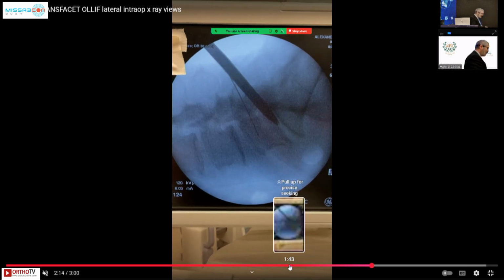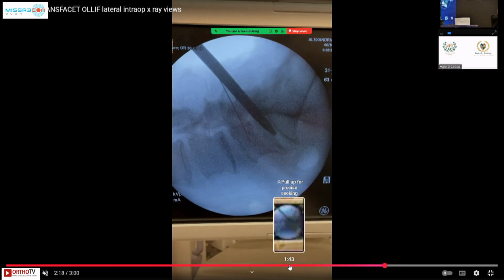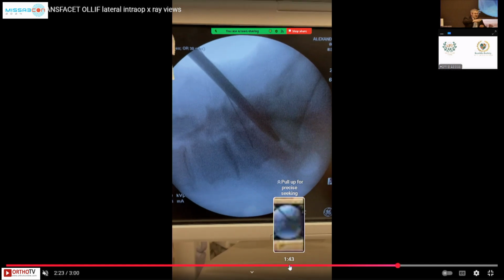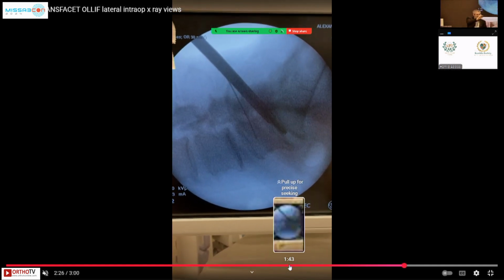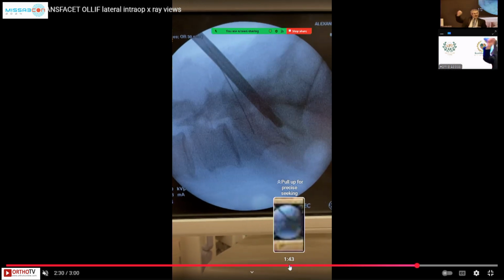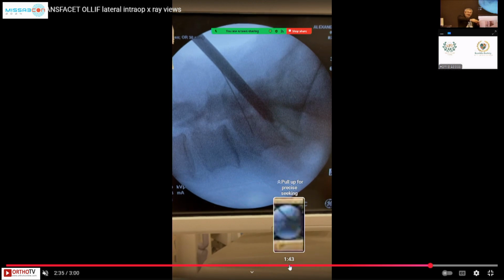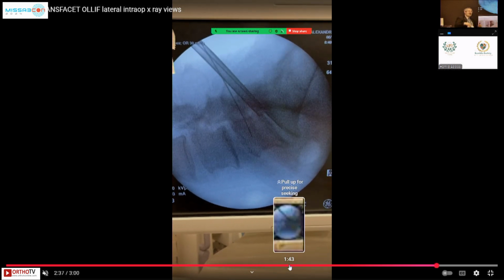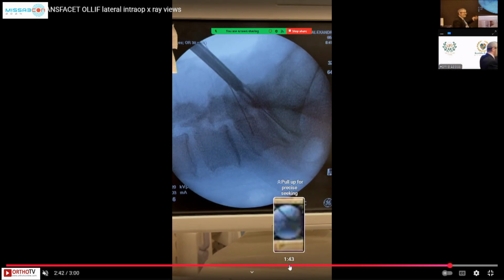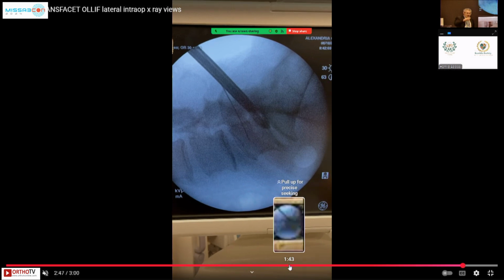Now, what you need to know about the anatomy of L5S1 is that S1, S2, S3 are practically already separating. They don't come straight down. They come in and go up before they go through the S1 foramen, and L5 goes lateral. So the axilla of L5 and S1 is a ginormous space. And in the AP films, you see you are very, very medial. There are two things important.